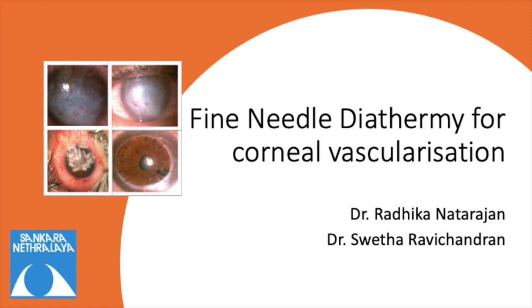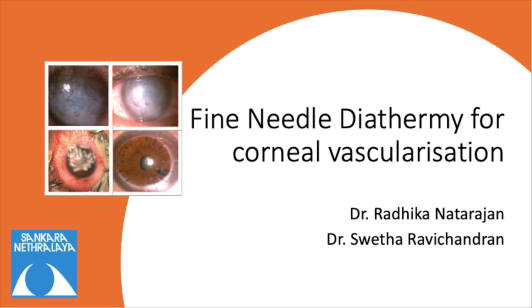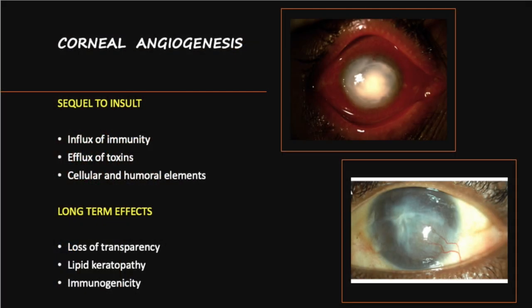Fine needle diathermy for corneal vascularization. Corneal angiogenesis occurs as a sequel to an insult to the cornea as it brings with it cells of immunity as well as repair and aids in flushing the toxins out.